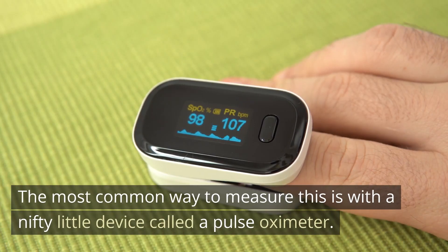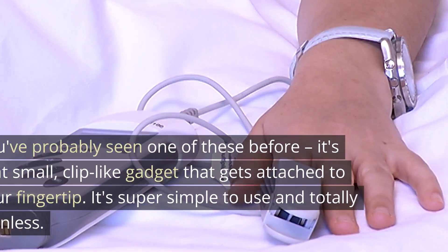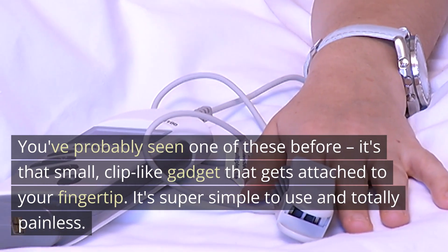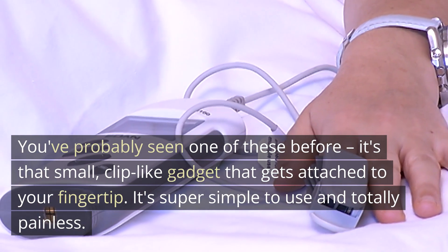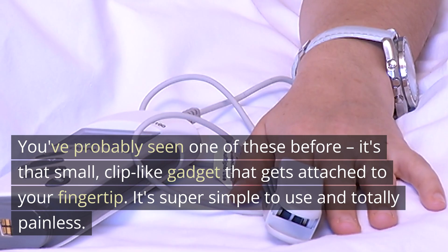The most common way to measure this is with a nifty little device called a pulse oximeter. You've probably seen one of these before. It's that small, clip-like gadget that gets attached to your fingertip. It's super simple to use and totally painless.